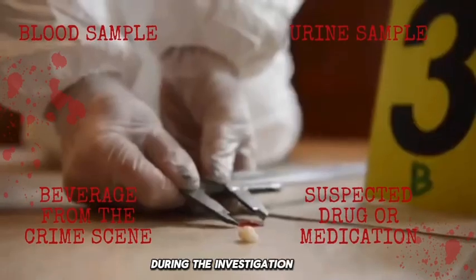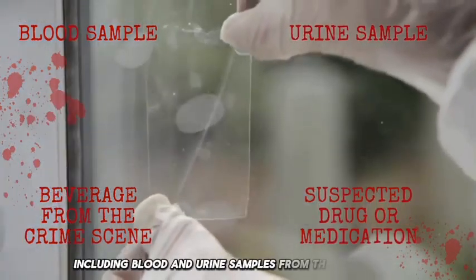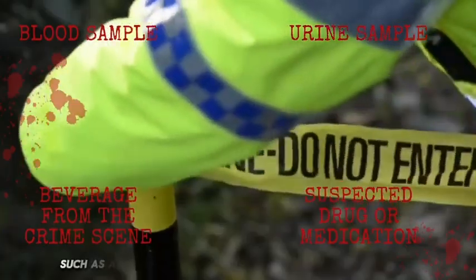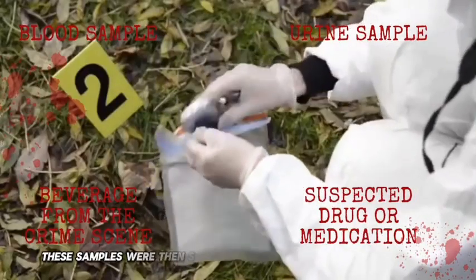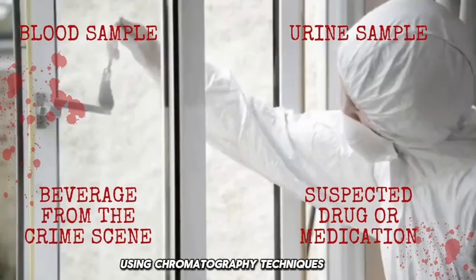During the investigation, forensic scientists collected important evidence, including blood and urine samples from the victim. They also collected possible sources of the poison, such as a drink or medication found at the crime scene. These samples were then sent to the laboratory for further analysis using chromatography techniques.